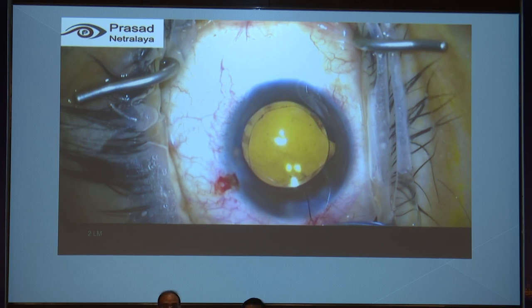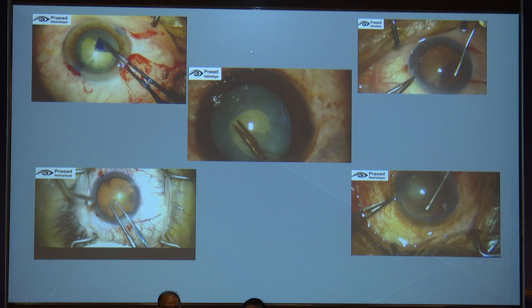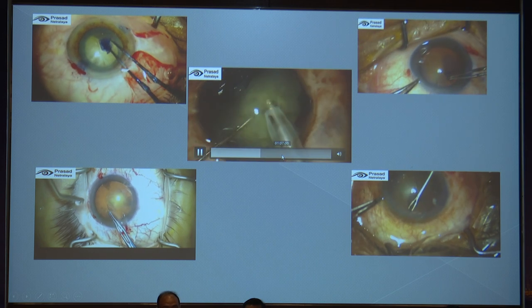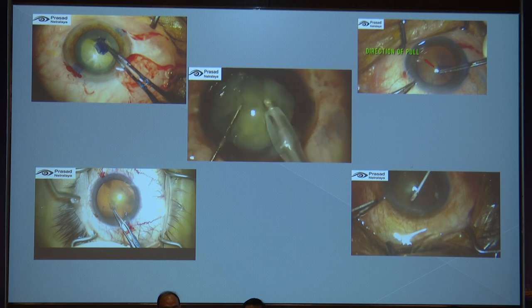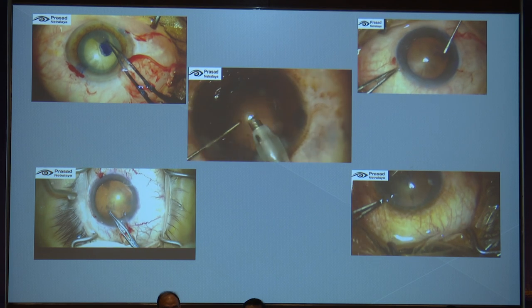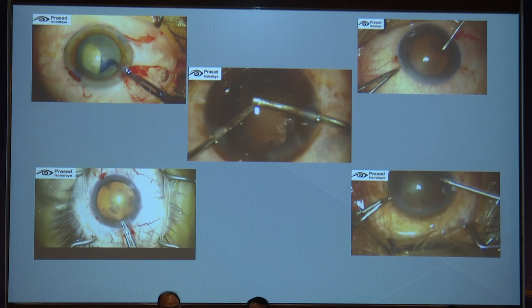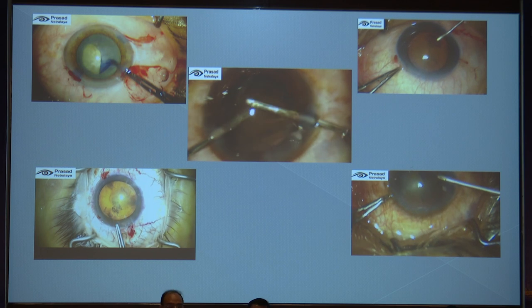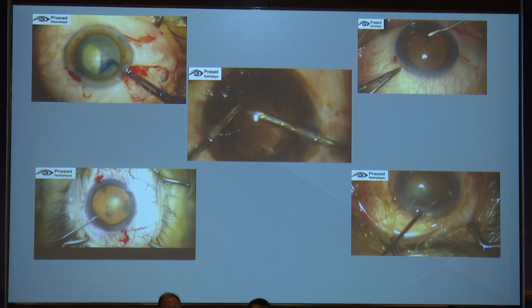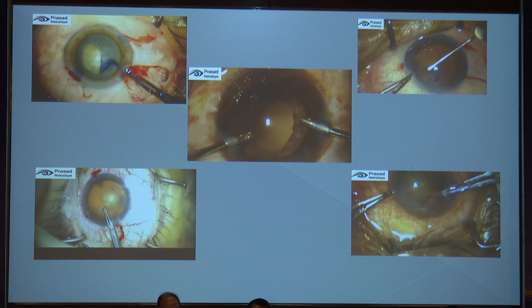If you can't make it continuous, there is no harm in giving a nick and then proceeding with the surgery. Even if there's a large runoff, a large tear, you can go ahead with the phacoemulsification. Be careful and slow down your surgery during that step. In cases where you're suspecting posterior polar and you're expecting a PCR, it may not be advisable to go ahead with the phaco, because then you have no support for your IOL other than putting an iris claw. In cases wherein you have planned a multifocal, maybe you might have to change your plan of action. But for all other routine surgeries, even if your continuity is lost, all is not lost. You need not convert from a phaco into an SICS.